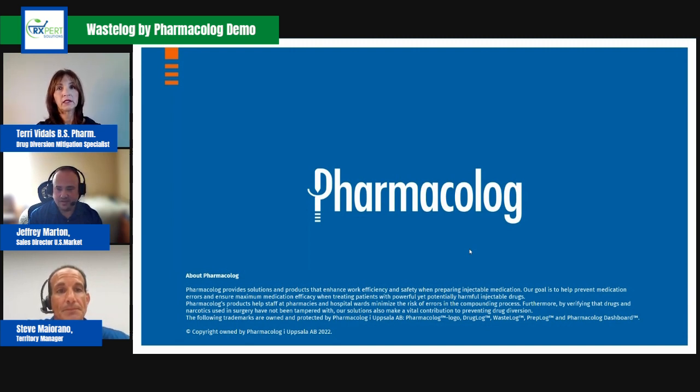I know that last time, when, go ahead. Sorry. No, Terry, I just wanted to say something real quickly. Aside from this machine helping for diversion, as I discussed in one of the slides in the presentation, it also picks up error. I mean, if there's the wrong strength.